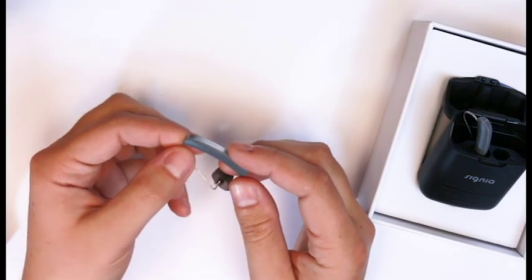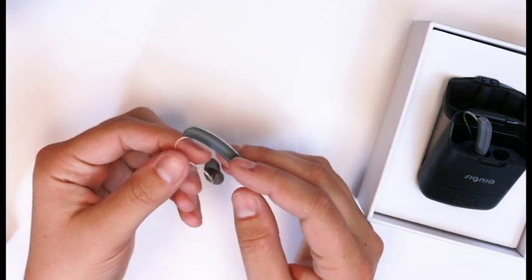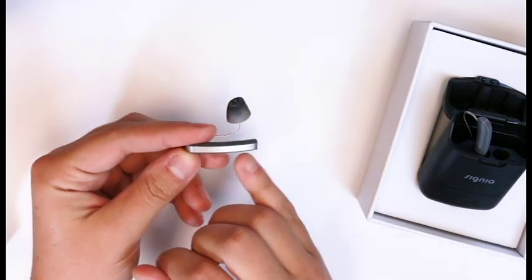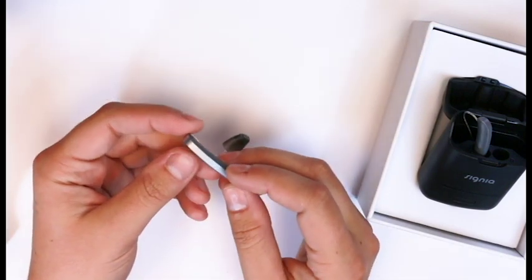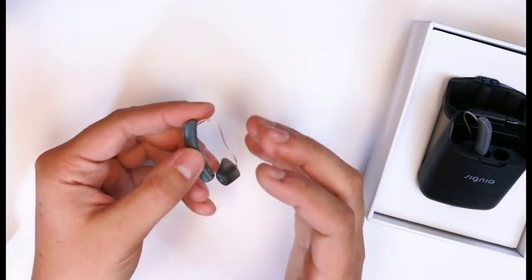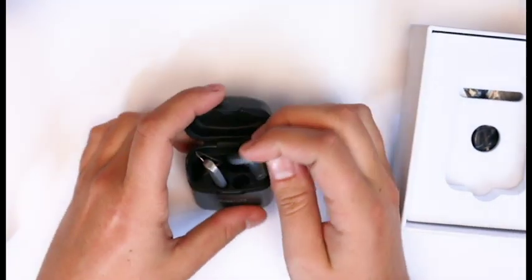It comes in three colors. We've got this dark granite, which is a kind of gray. They've also got a white and a cosmic blue — the white and the blue come with a rose gold on the back, while this one comes with a chrome or silver finish, very similar to the coloring you'd see on a smartphone. It just pops right into the charger.